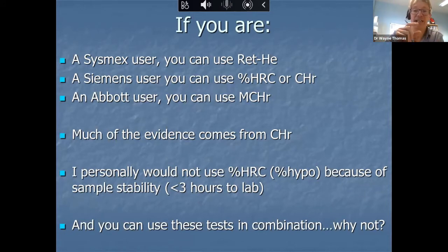Well, the reticulocyte count is an answer to the question of what the bone marrow is doing about it. So if you're doing a reticulocyte count, you're going to get a reticulocyte hemoglobin. Great. So that will tell you if they're iron restricted or not, provided you can exclude carriage of thalassemia.